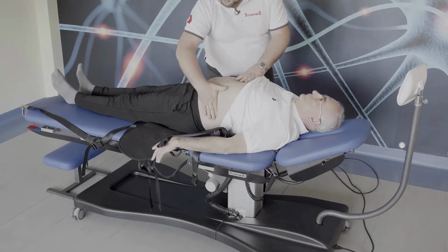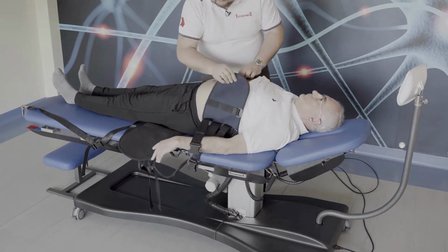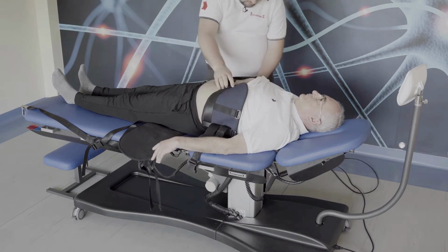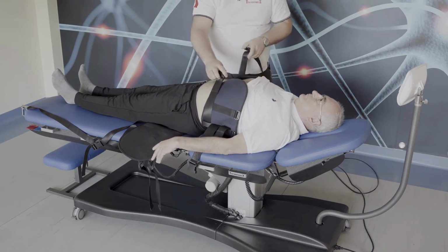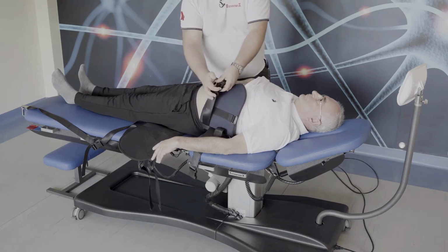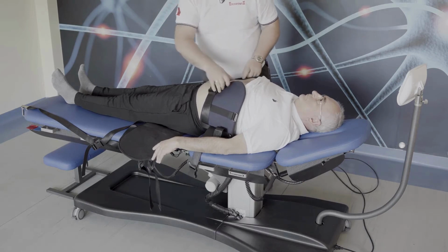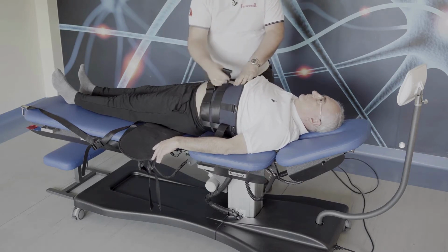So it should go like this, to pull up. It's not needed to close the patient very tight at this moment. We will do it at the very end.